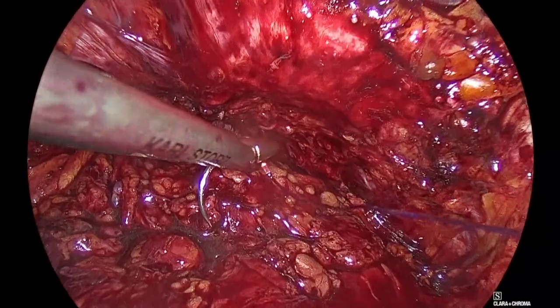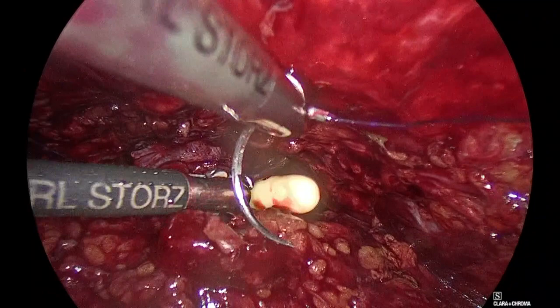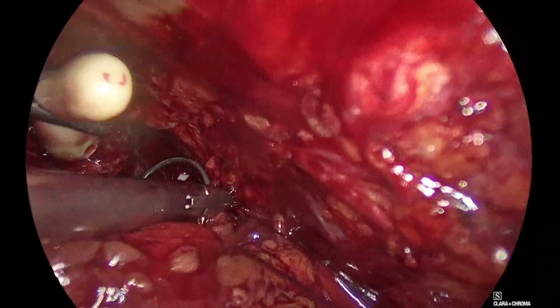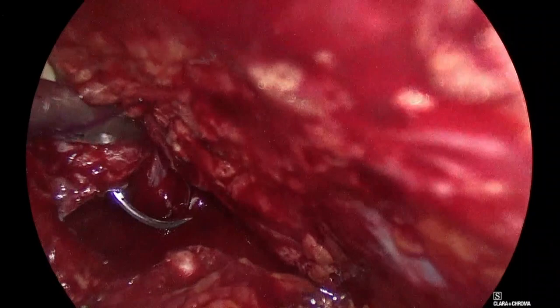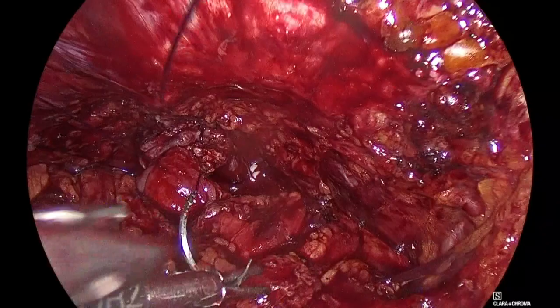Catheter in, please. Show me to the right. In. A bit more. Stop. Good. Padeli, to the right. To the right, Padeli. Good. See, now it does it by itself, huh? Okay, Padeli. Stop. Yeah, it's pulled in. So it gives you a nice, very nice feel to suture. Go back. Good.